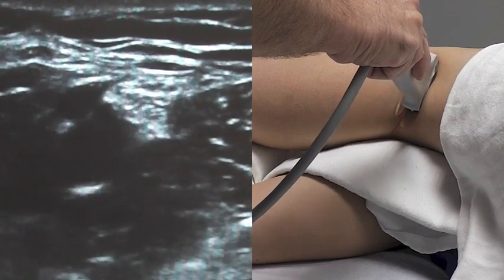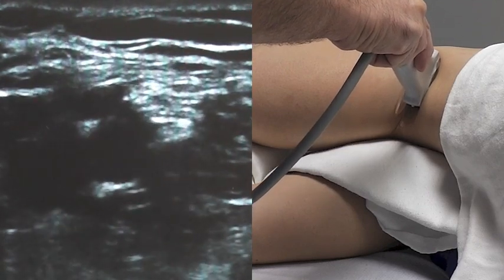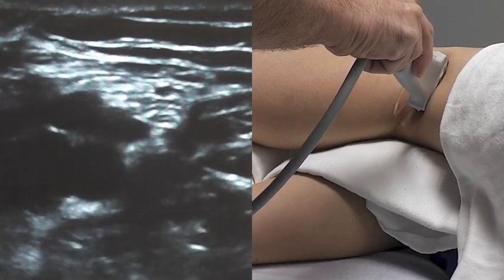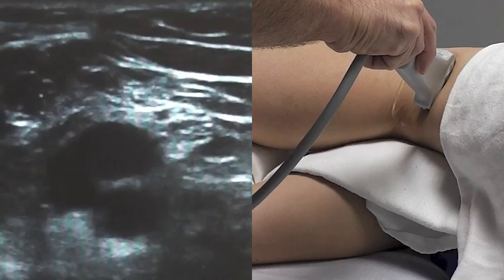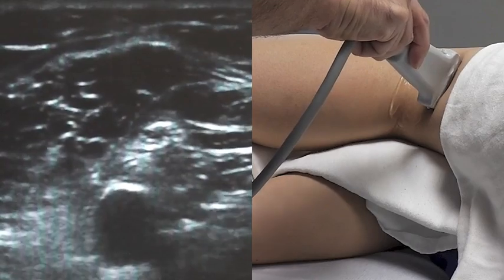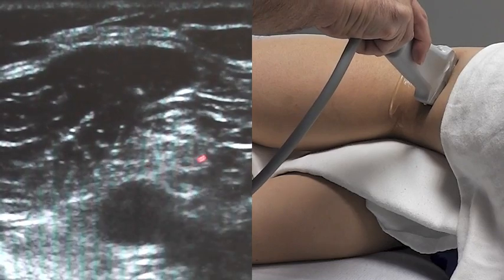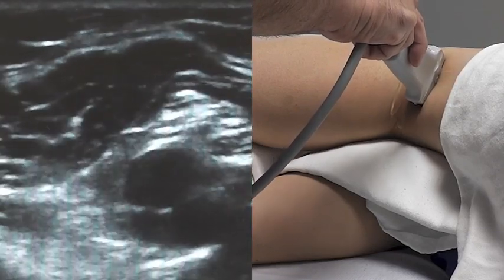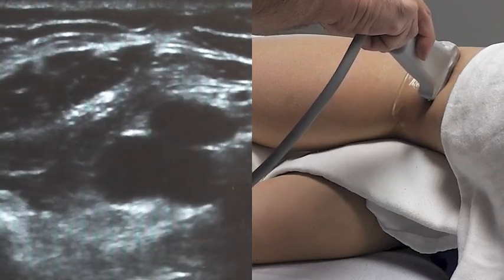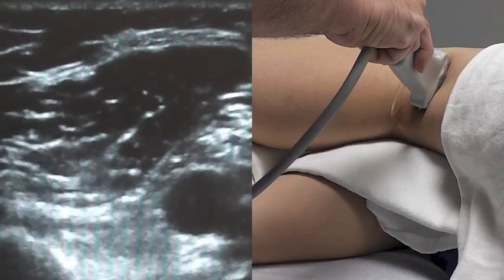At this point, we know that the sciatic nerve is already split into the tibial and peroneal components. So I'm going to gently move the probe cephalad to see if we can find where these two segments join to form the sciatic nerve, which they've just done now. I'm going to trace back to the fossa and watch them separate — here are the two components, one and two. Moving cephalad, they join together. Moving caudad, they're separating right now.